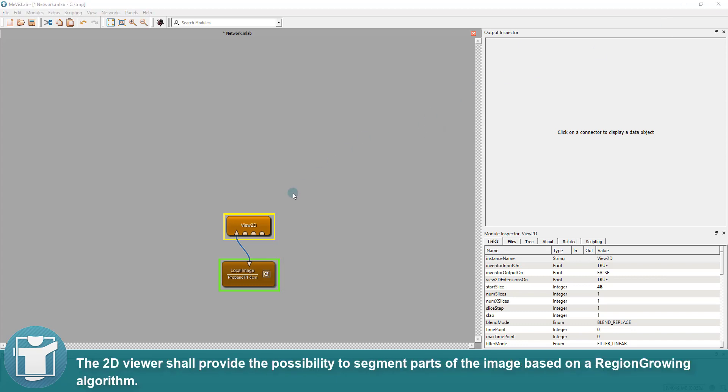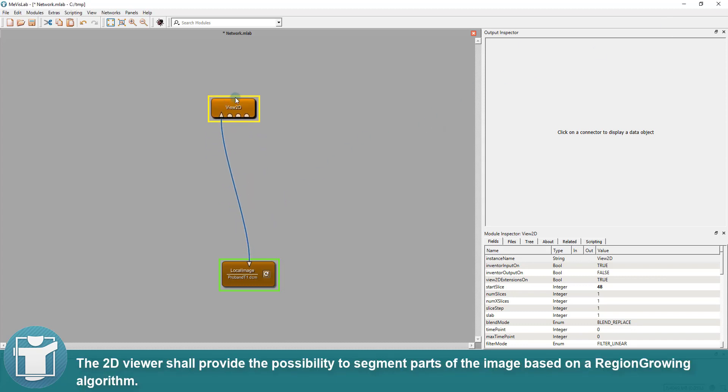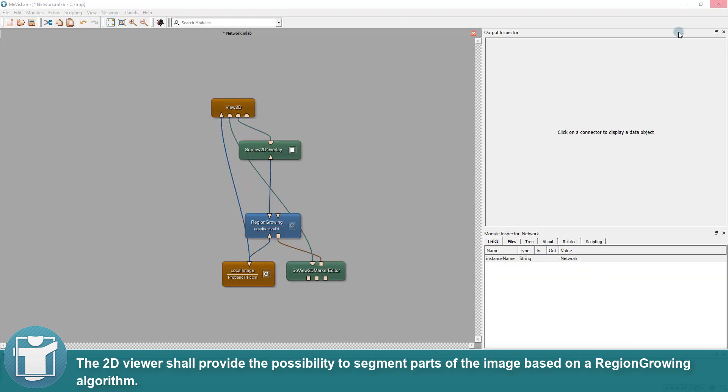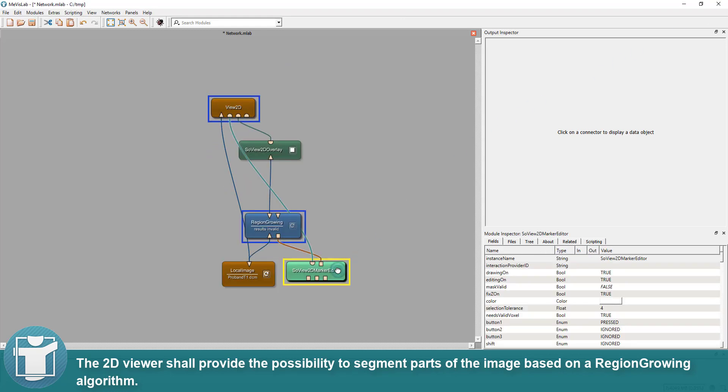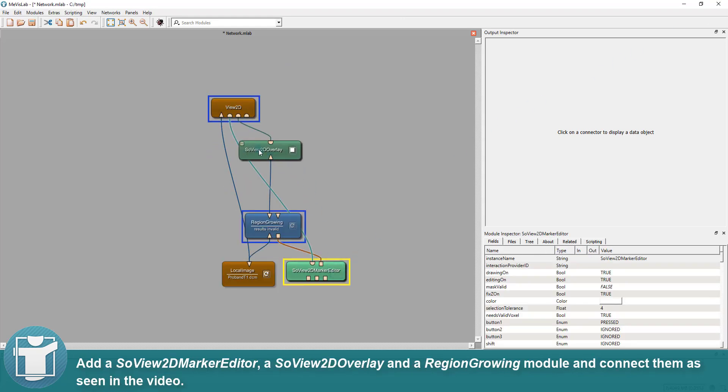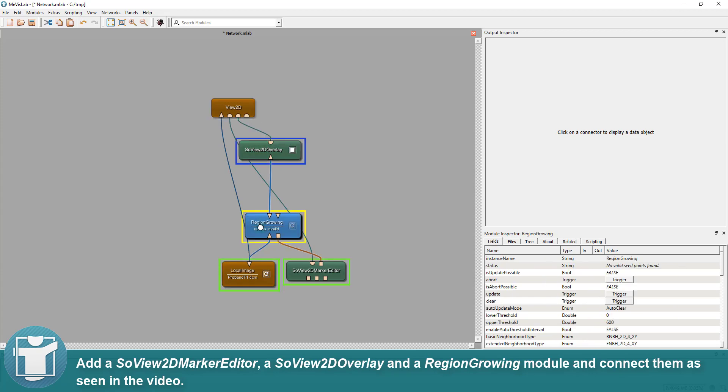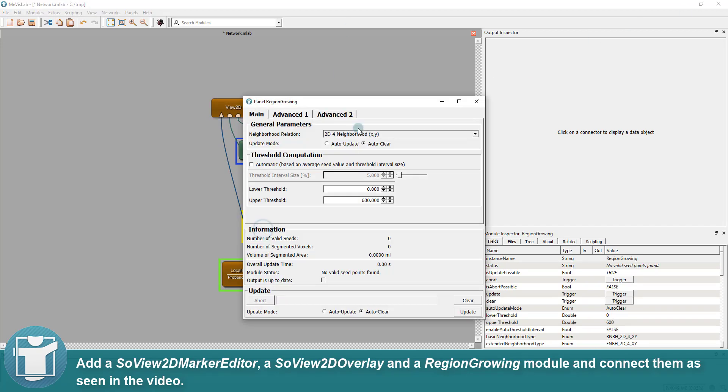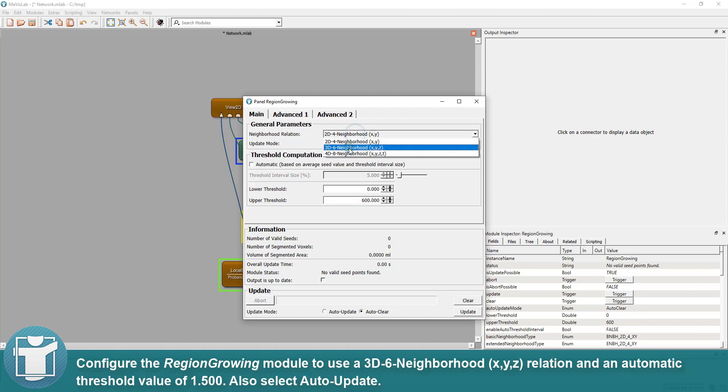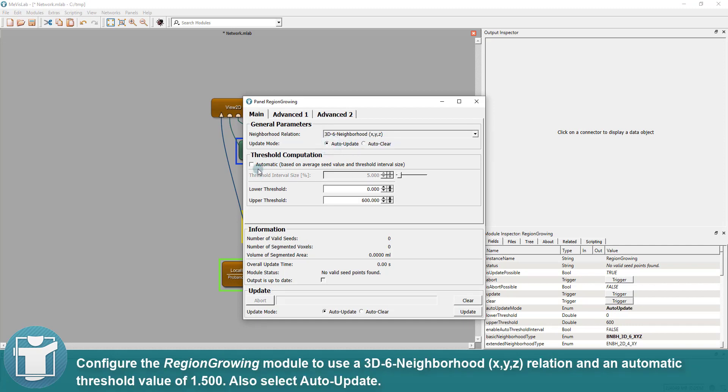The 2D viewer shall provide the possibility to segment parts of the image based on a region-growing algorithm. Add a SoView2D marker editor, a SoView2D overlay and a region-growing module and connect them as seen in the video. Configure the region-growing module to use a 3D6 neighborhood relation and an automatic threshold value of 1.5. Also select Auto Update.